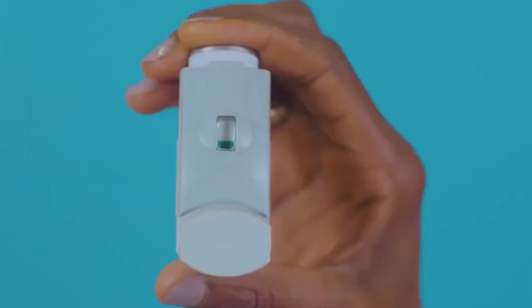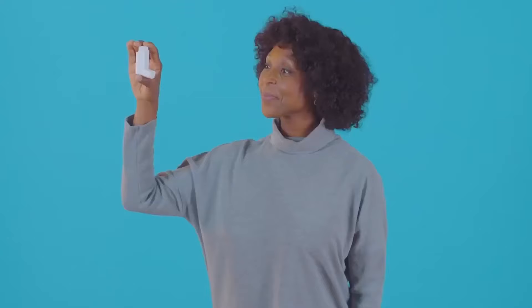Some PMDI inhalers have a dose counter. If yours has one, check it is not empty.